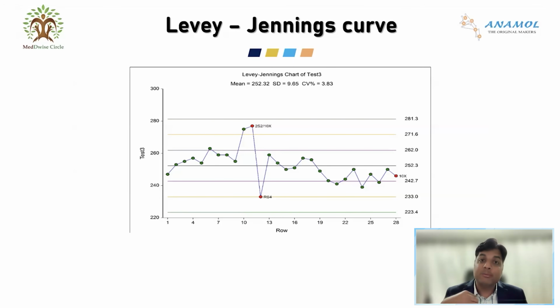Then can I depend on the results of SGOT of that particular day? Answer is no. I cannot depend upon the SGOT test that I have performed on that particular day. So something is wrong. I need to check what is wrong. So this is how controls are used in our day-to-day life.